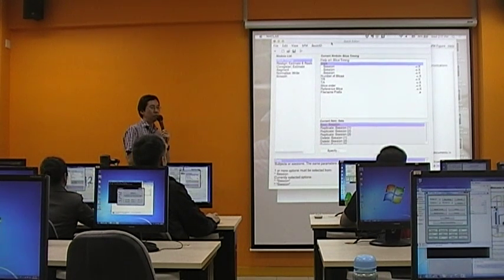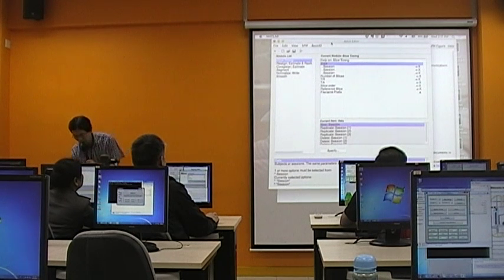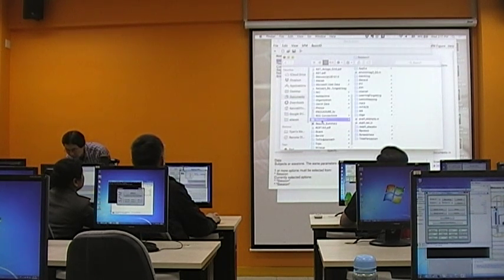For those of you who haven't joined the first session, you need to know that we have a folder of sample data set, called in German Beispielstudie, which is something like example data set.